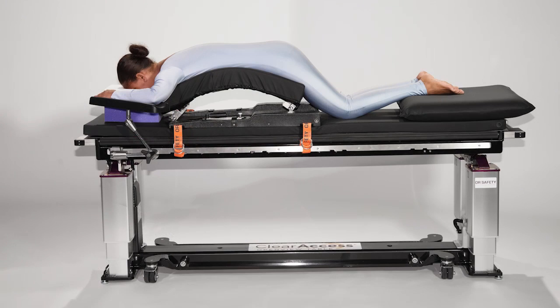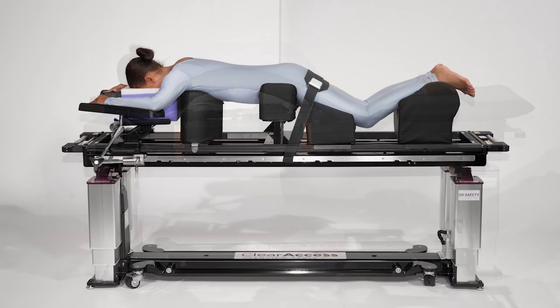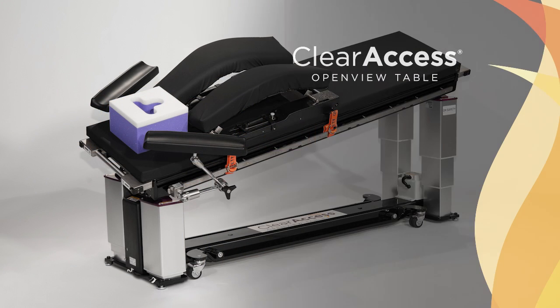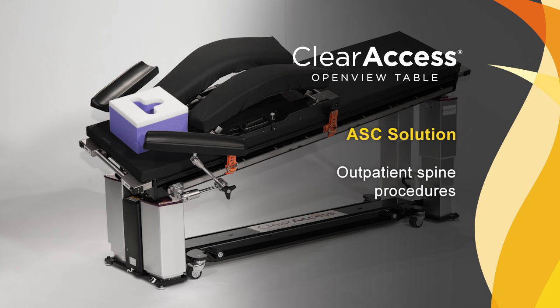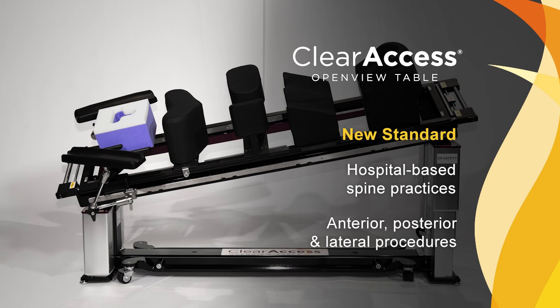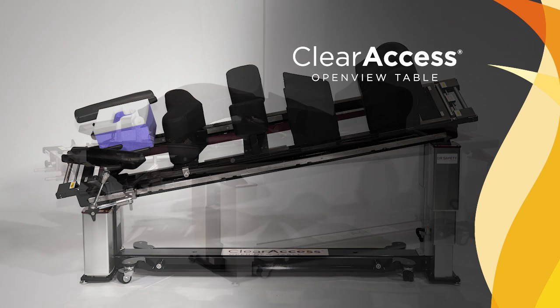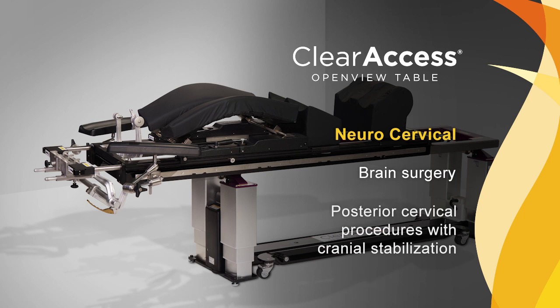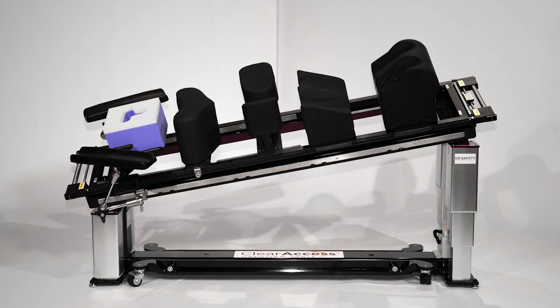Importantly, the Clear Access table is the only spine table on the market with three preset configurations, each organized in response to customer feedback and intended to deliver the right amount of equipment for specific clinical practices. The ASC solution supports outpatient spine procedures and interventional pain management. The New Standard is configured for hospital-based spine practices supporting anterior, posterior and lateral procedures. The neuro-cervical configuration supports brain surgery and posterior cervical procedures requiring cranial stabilization. In this video, we will highlight the New Standard configuration.